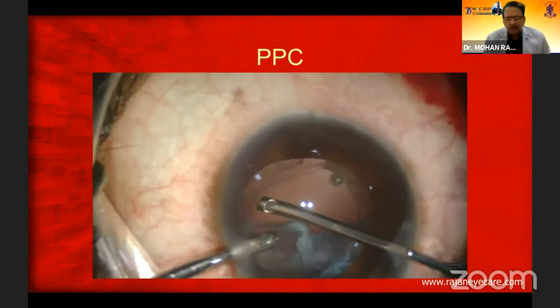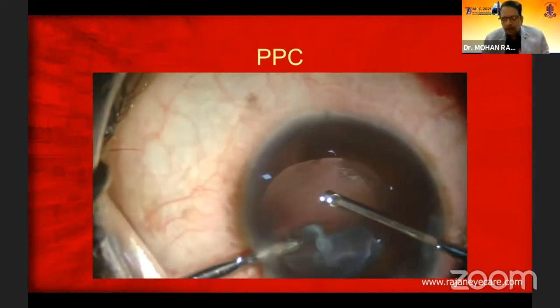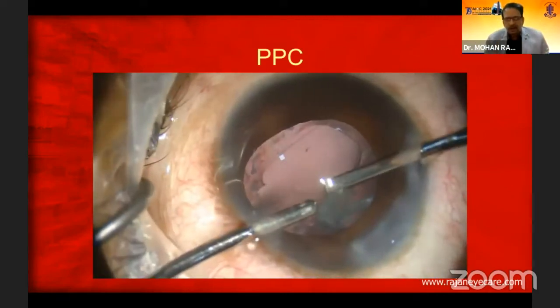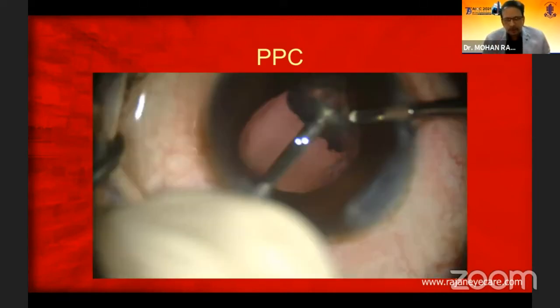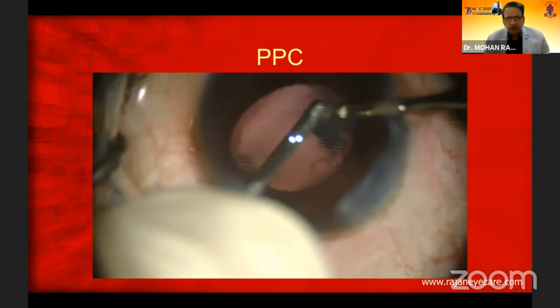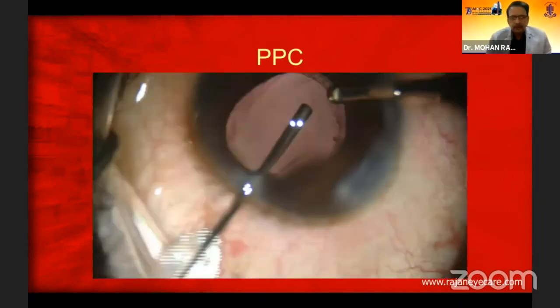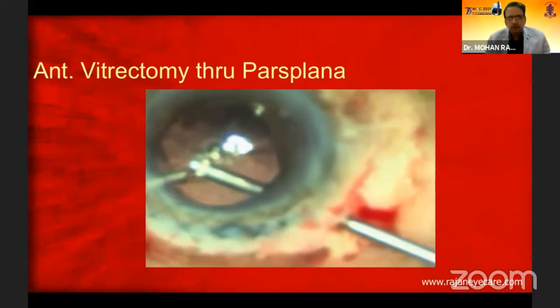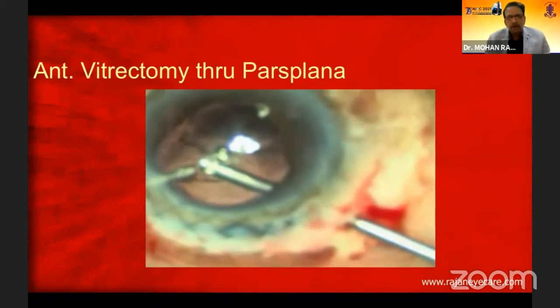Remove the vitreous first. Use always a bimanual automated vitrectomy — don't use a Weck-cel sponge or similar. Always remove the vitreous first and then remove the cortex as well. This is again very, very important. Anterior vitrectomy through the pars plana is also very, very important.